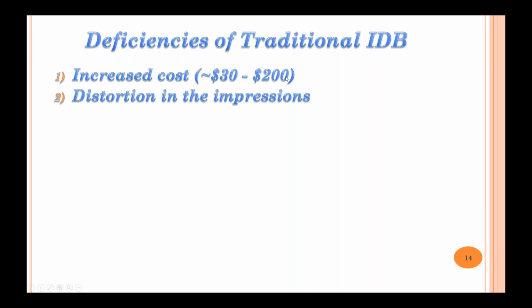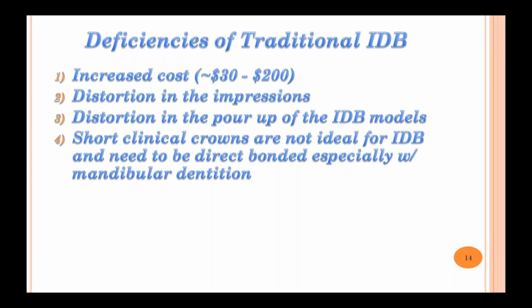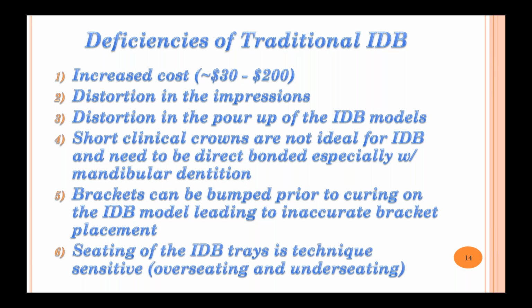There's also potential distortion in impressions, which could obviously lead to inaccurate models. There could be distortion in the pour up of the indirect bonding models, with blebs or bubbles where you get voids in the model itself. Short clinical crowns are not ideal for indirect bonding and need to be direct bonded, especially with mandibular dentition. Obviously, you have to keep the bracket more gingival so you can keep it out of inner arch interferences. Brackets can be bumped prior to curing on the indirect bonding model, leading to inaccurate bracket placement. And seating of the indirect bonding trays is technique sensitive.